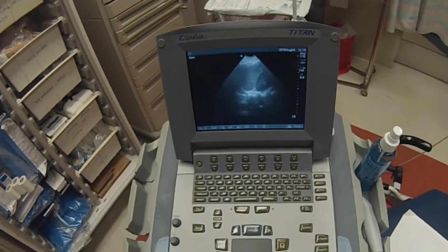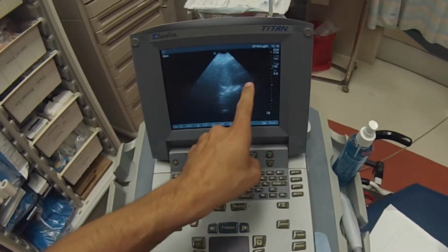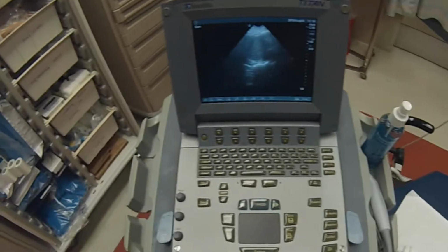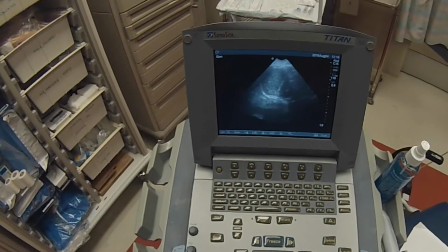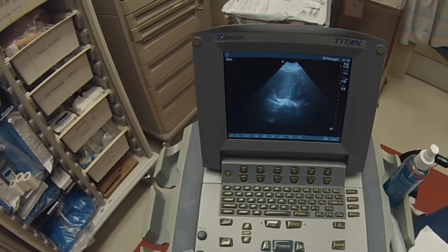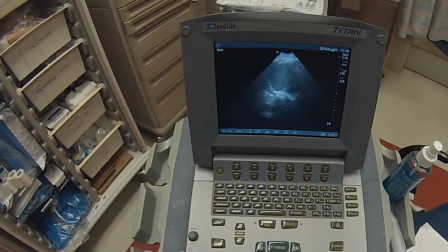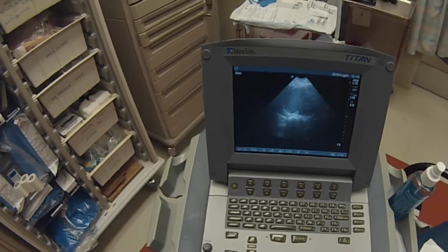Second thing to look for, again, just like in the right upper quadrant, the spinal stripe should stop here at the diaphragm. We shouldn't see it continue up into the thorax, just like he does not. The third thing to look for here is actually an evaluation quickly of the spleen. Sometimes in trauma, you'll have a subcapsular injury, and fluid will collect up here under the diaphragm around the spleen, and it'll make the spleen kind of look like a jellyfish floating in fluid.